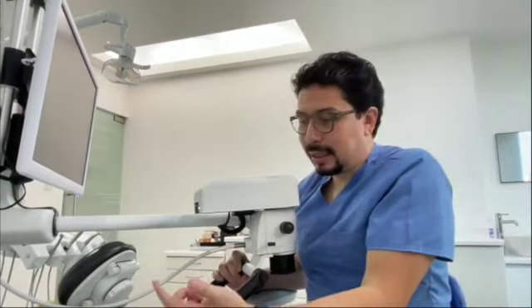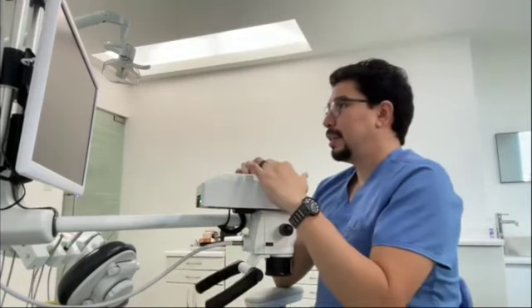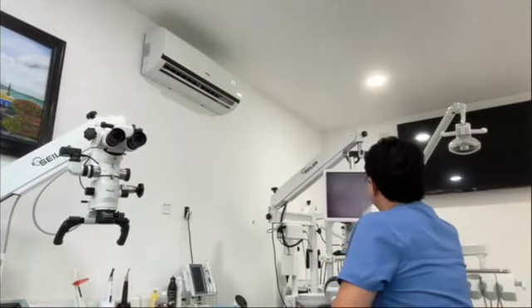What you need to do, guys, I give courses about microscopy and 3D microscopy. And for my students, it's quite easy. They just need to turn on the microscope, sit in the center of the screen, and that's it. Piece of cake. There are not a lot of tricky steps to perform when adjusting the microscope to the student or to the clinical practitioner.